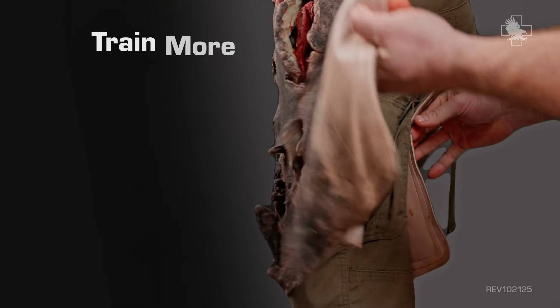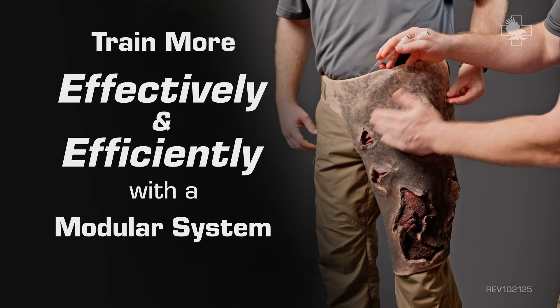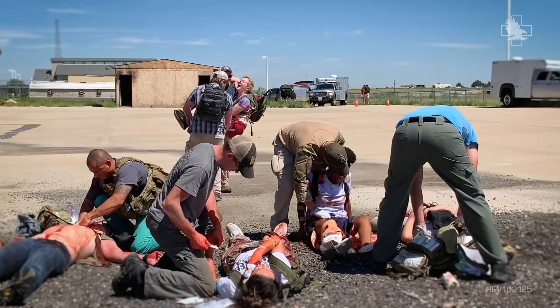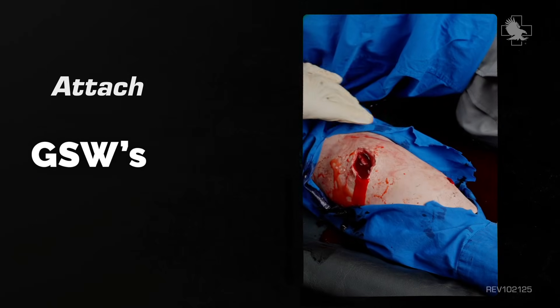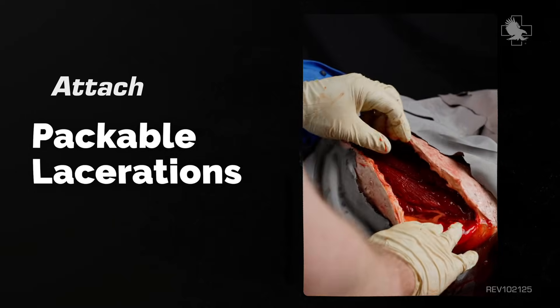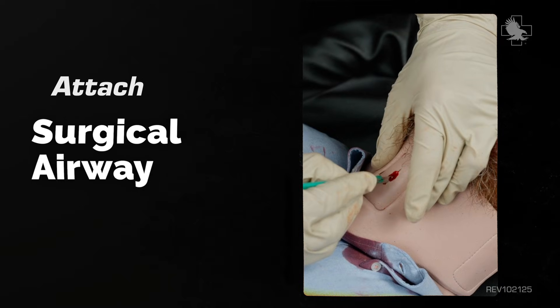Get ready to train more effectively and efficiently with a modular training system you can use to build any crisis scenario. Attach lacerations, GSWs, fractures, knee wounds, packable lacerations, burns, surgical airway, and much more.